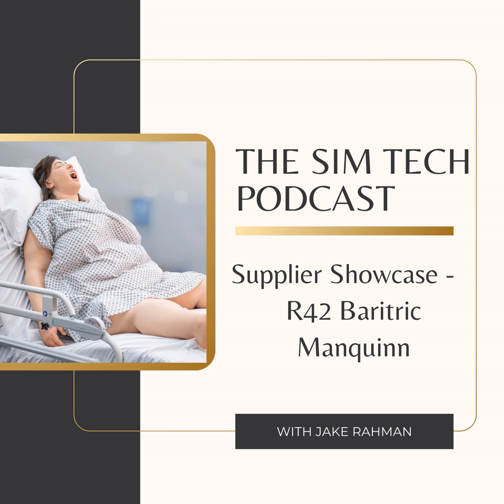And just to labour on the 3D printing side of it, because she's 3D printed, and the type of filament they use, it's completely recyclable. So if one comes back to the workshop and it's broken, or you want to swap it out for a new one over time, that filament can be repurposed and reused to build a new one. And that was part of the sustainability side.